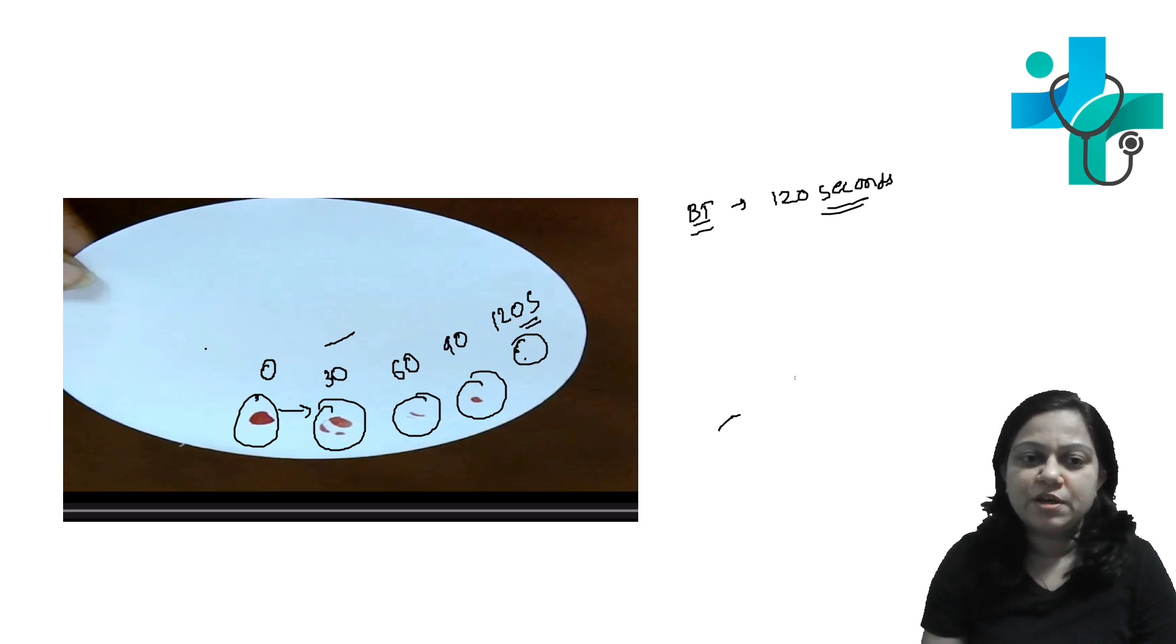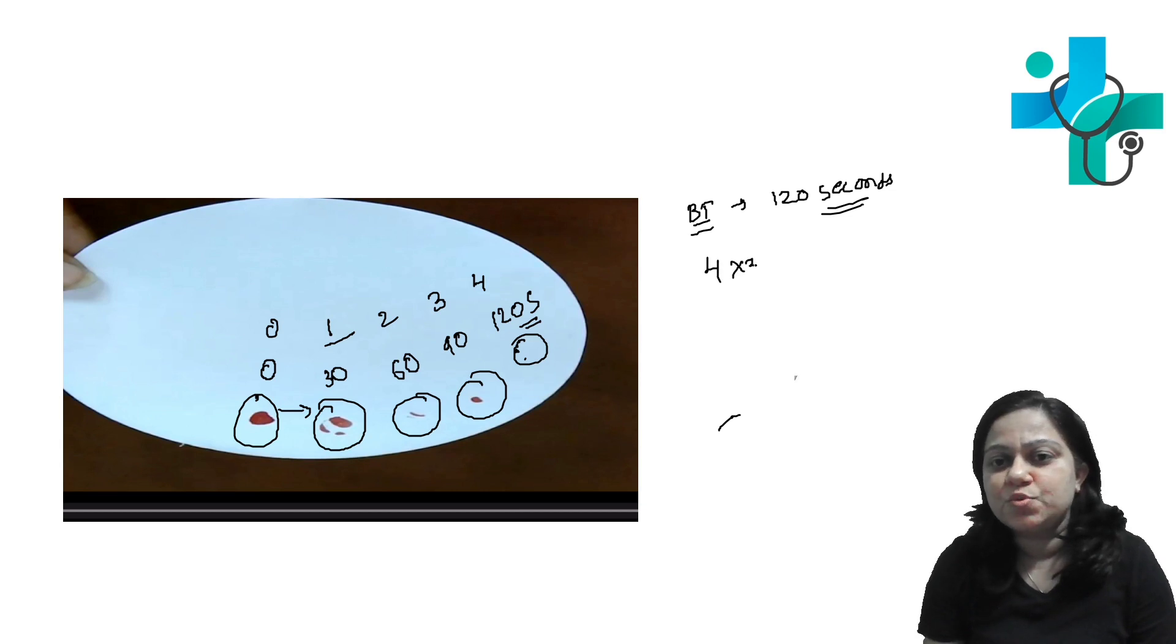You can also count the drops. Start counting from zero: zero, one, two, three, and four. Multiply it by 30, so it is 120 seconds.